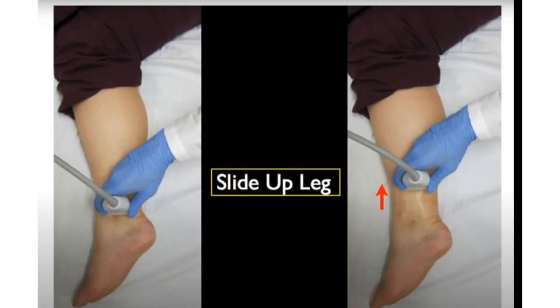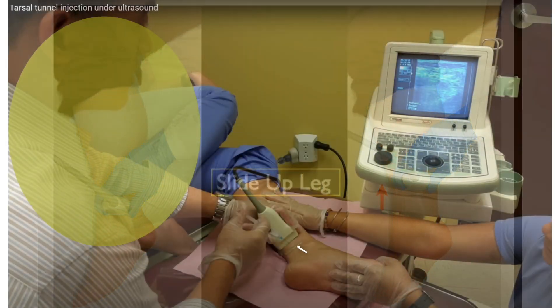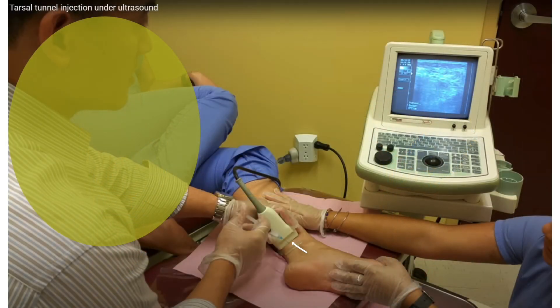I trace the tibial nerve from distal to proximal by sliding. I noticed that some doctors select the target above the tarsal tunnel in tarsal tunnel injection.